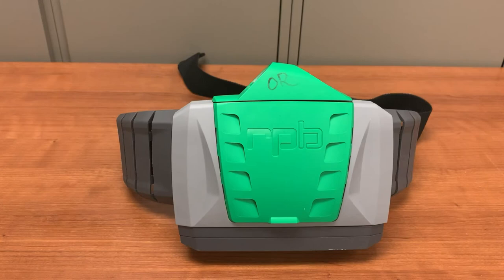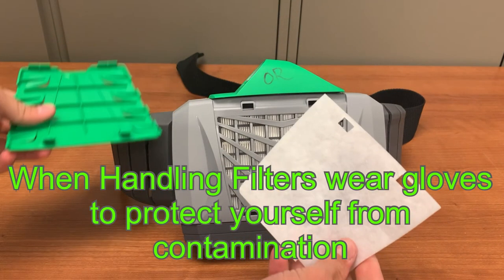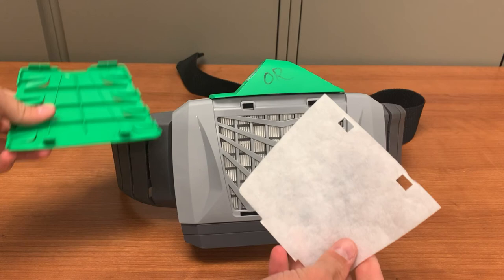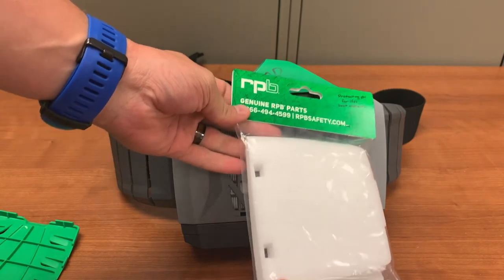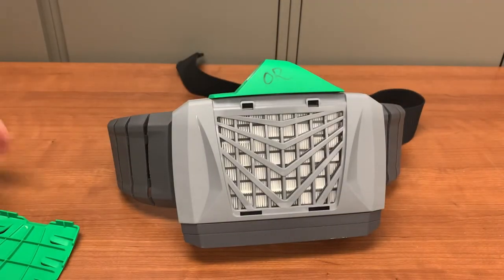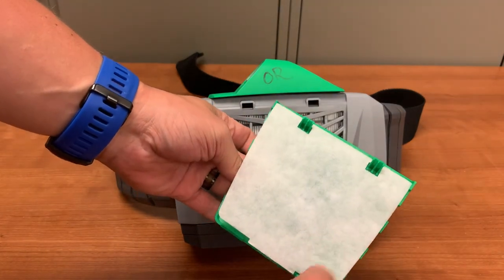If airflow is low, the filters may need to be replaced. As the filter nears its capacity, the PAPR has to work harder to pull air through the increasingly clogged filter. First, check the pre-filter, which is located under the green panel on the PAPR. Open it by lifting from the bottom of the panel. The white filter paper is the unit's pre-filter — it collects larger dust and debris before air is pulled through the HEPA filter. It should be changed anytime there is an airflow issue or if it is visibly discolored or dirty. These filters are available on your unit. To change the filter, simply take a new clean pre-filter, hook it to the plastic prongs on the green cover, and snap the cover back into place.